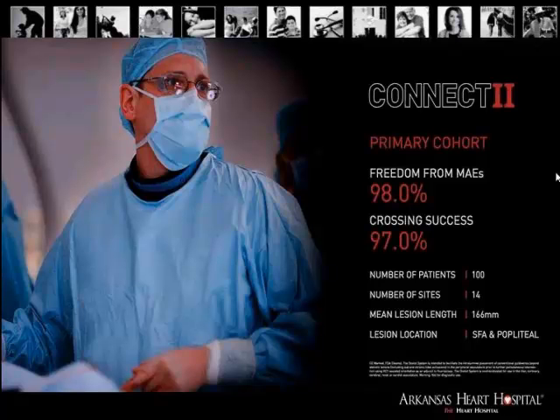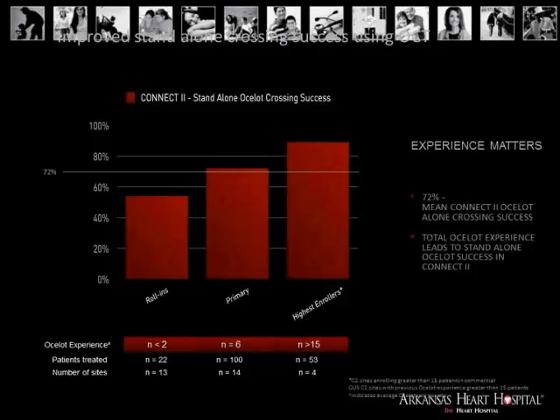The catheter was studied in the Connect 2 study, which we were a part of. This was done in 2012. A couple of points that came out of this study were that experience matters. When we looked at the highest enrollers for the study versus the centers that had smaller enrollment, we noticed that standalone crossing, just using the device, was better.